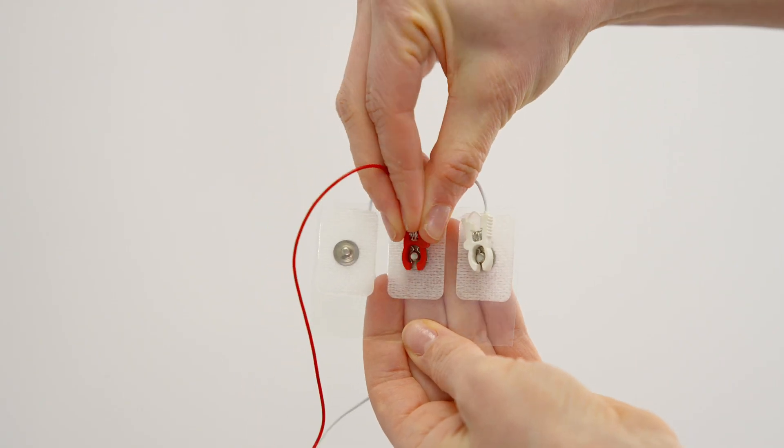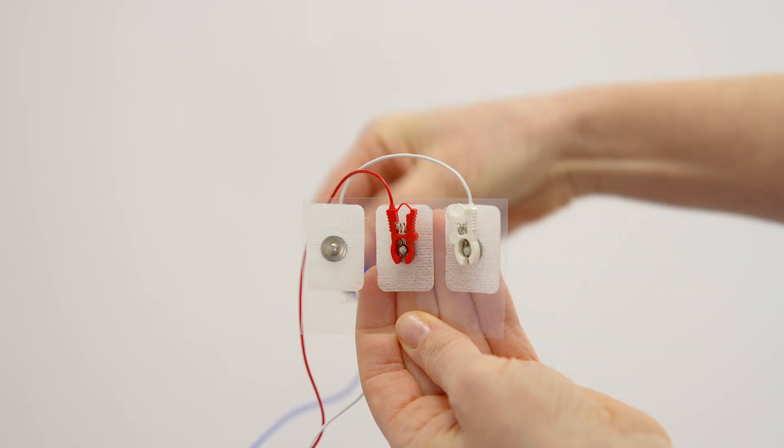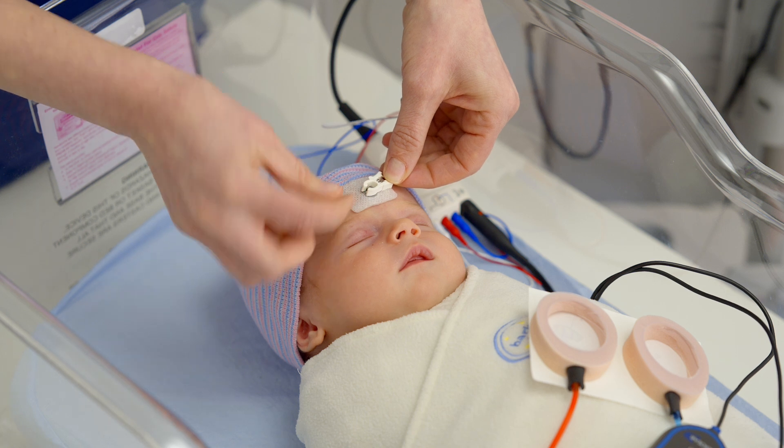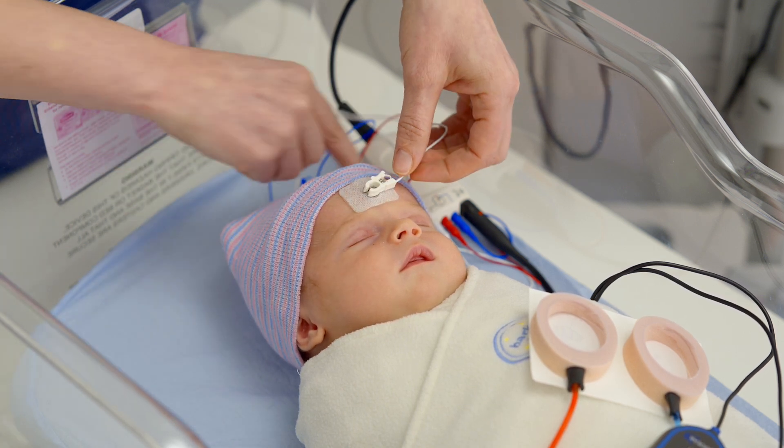Attach the white, red, and blue electrode lead wires to the snap electrodes. Peel the electrodes from the backing card and place them on the baby where you prepared the skin. Press gently around the entire surface of each electrode to secure it.